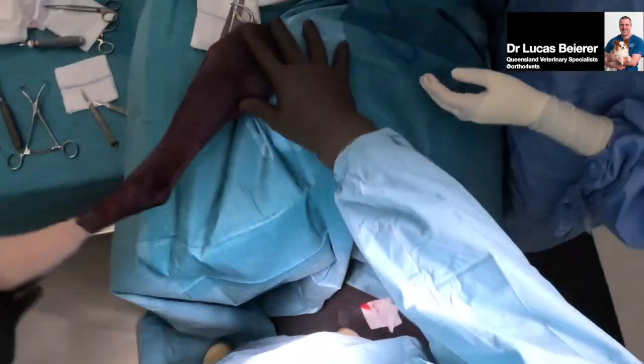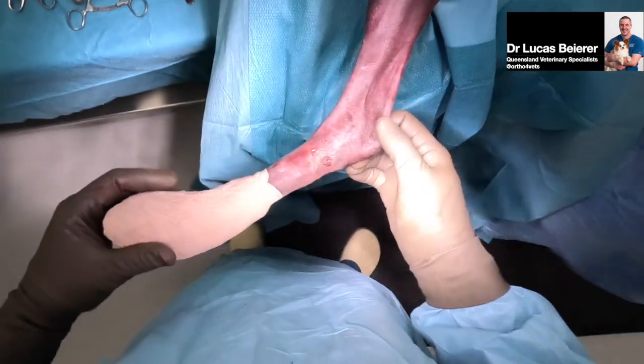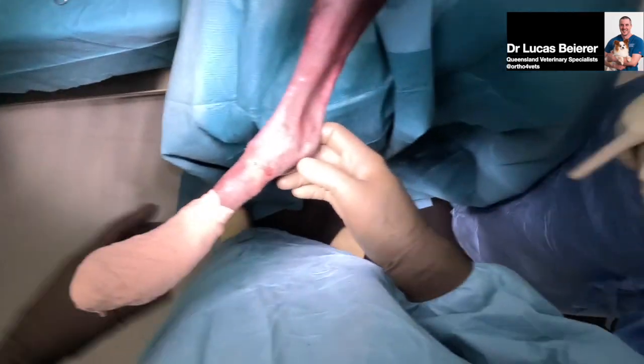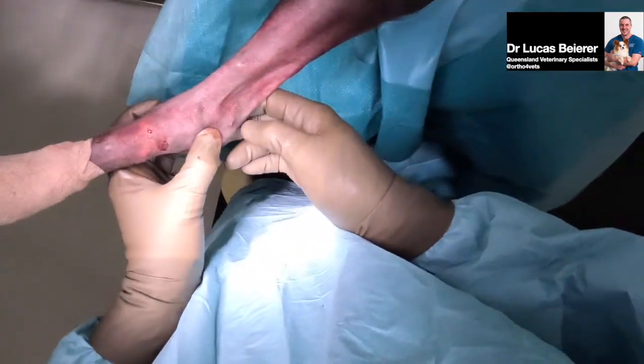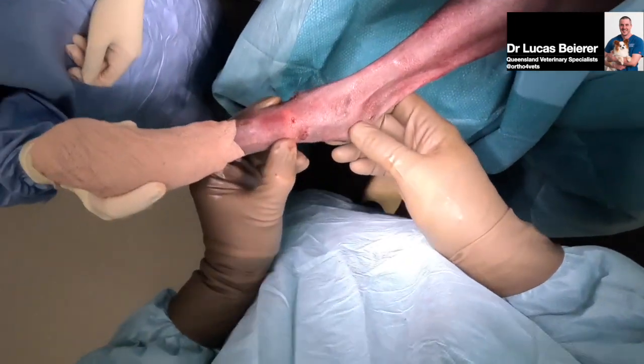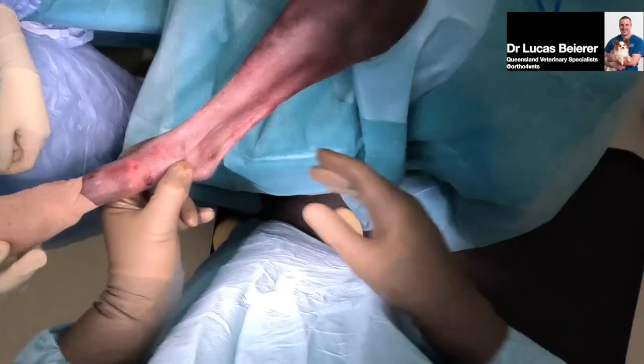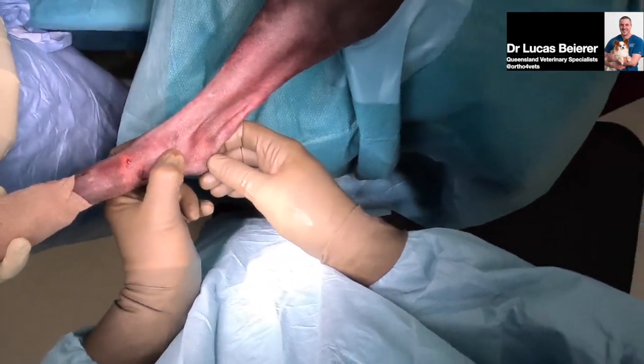All right, so let's try and get this done. Do you want to go on that side, Sitch? So we don't want to have too extensive an incision. I think I can already feel that screw coming through there. Oh, don't worry about the mat, mate, it's all good. Thank you, yeah.